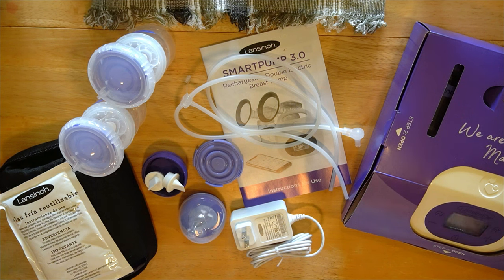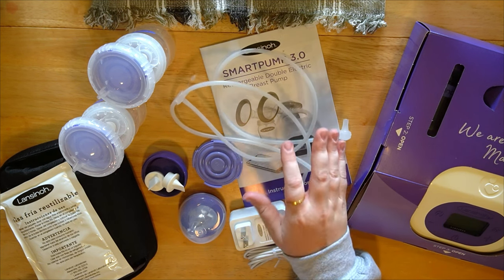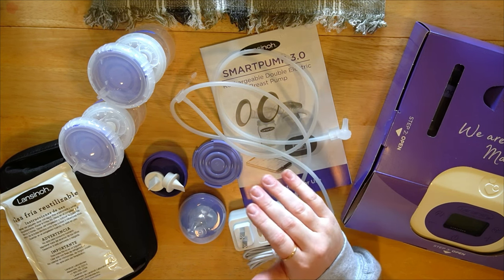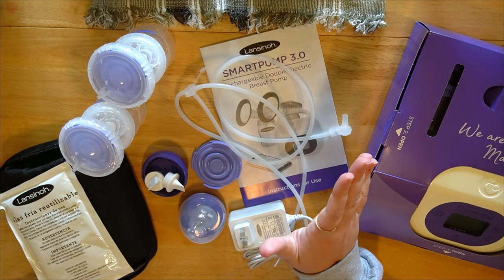Hey everybody, today we are going to go over how to use your Lansinoh breast pump 3.0. You guys know that for a long time through my breastfeeding journey I have loved the Lansinoh pumps — I had used the Signature Pro, the Smart Pump, the 2.0, and now we have the 3.0. I'm not breastfeeding anymore so this will not be a review but it will be a how-to.